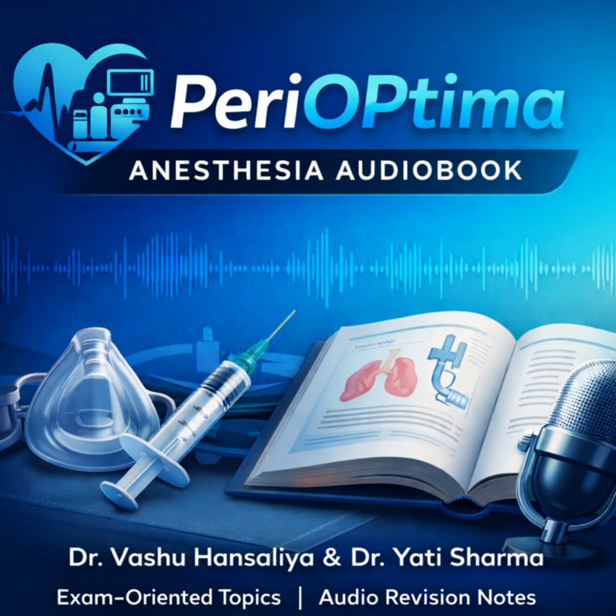It's a perfect reminder that even the most sophisticated electronics don't eliminate the need for clinician vigilance and a solid understanding of environmental physics. We are now at the final layer, the patient circuit itself. This stage is about protecting the patient from their own exhaled gas, from pressure extremes, and ensuring that final mixture is what we think it is. Right. This area covers both mechanical protection and observational safety features, right up to the patient interface.